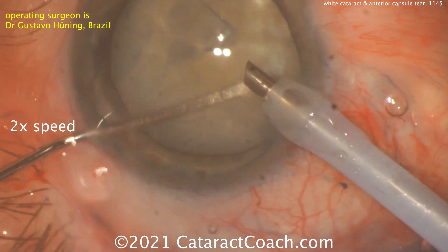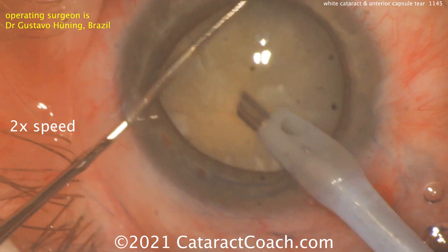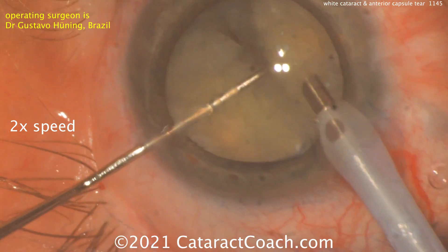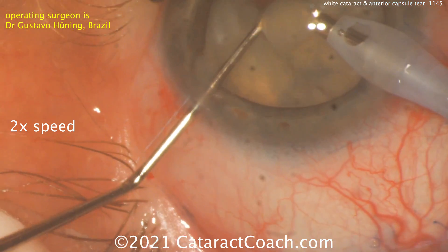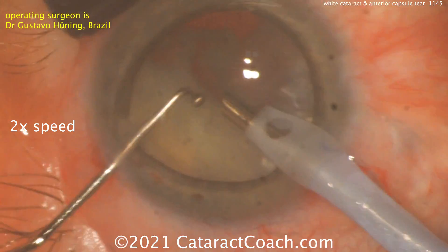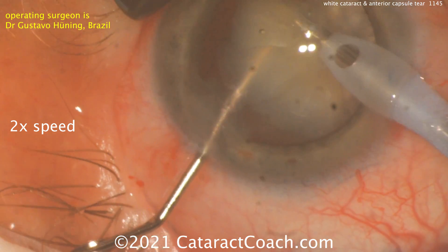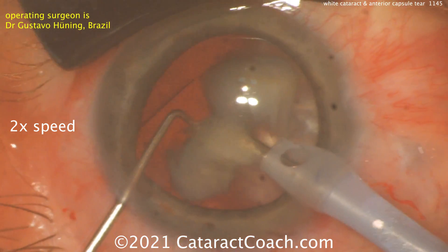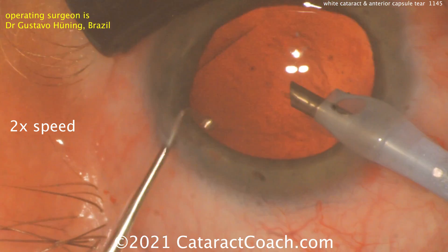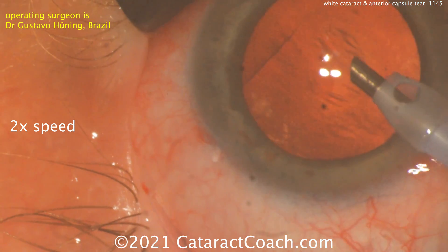Let's watch this surgeon in action. Rotating the lens to make sure it's freed up — it looks like a chop technique of some sort. He's holding the nucleus with the phaco probe and using the chopper, getting some chops in there, then removing pieces bit by bit. You want to avoid too much manipulation in the capsule bag. If you do a divide-and-conquer technique and push outwards towards the lens equator, you may cause that anterior capsule tear to zip out or become worse. You can see the capsule right where the chopper is, and there's that anterior capsule tear — just being very cautious here.